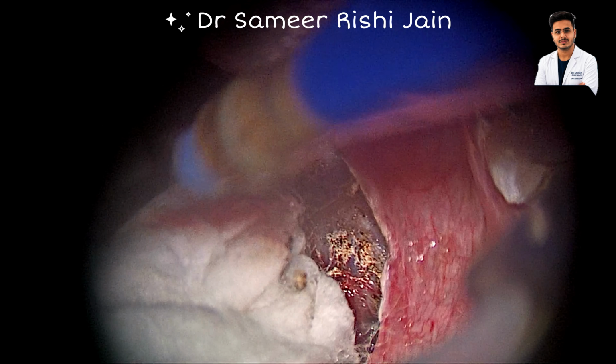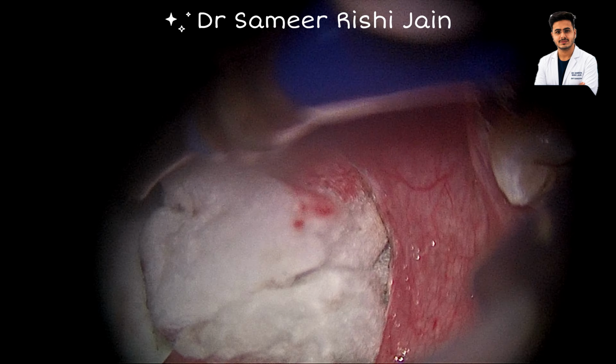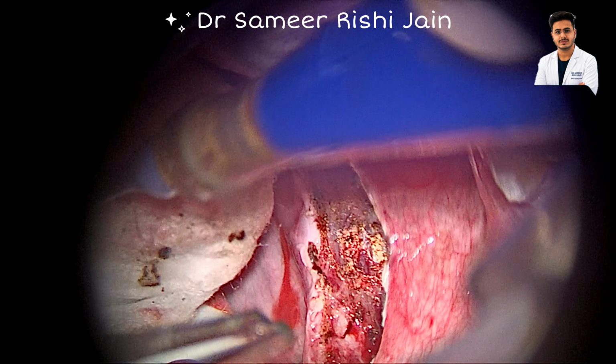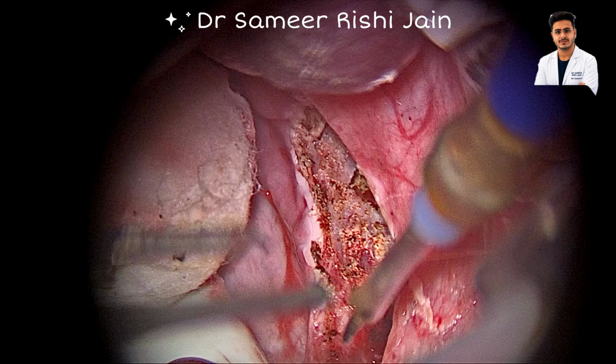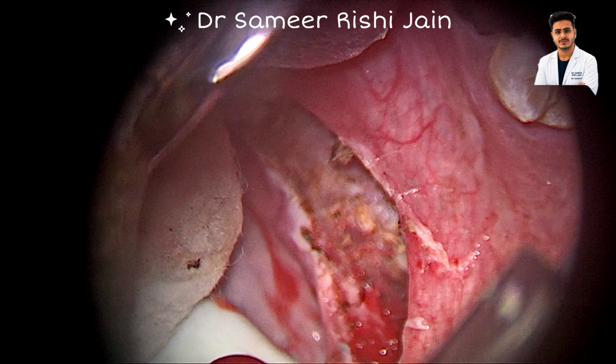As compared to the conventional cold steel tonsillectomy method, where there is a good amount of bleeding from the tonsil, here you can see very minimal bleeding, and the fascia is also preserved in the maximum area of the tonsillar bed.